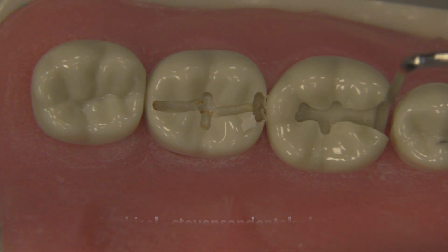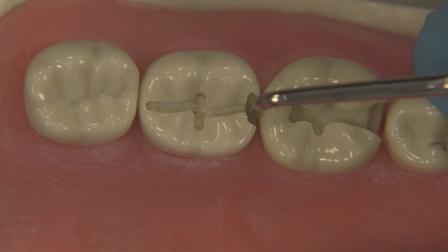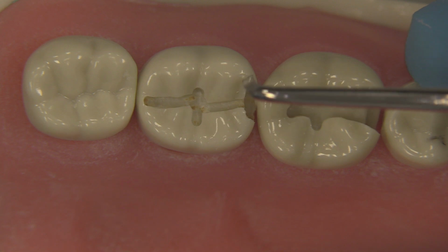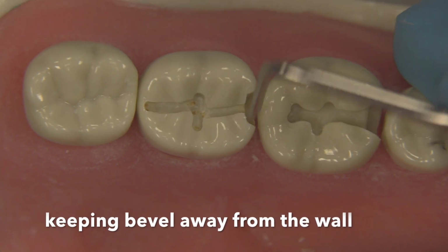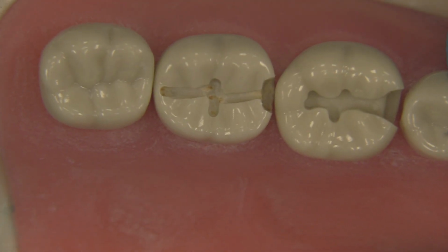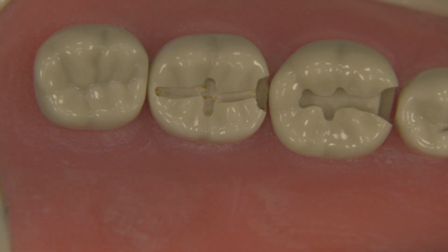And then this is what I meant by chipping. Turn the instrument around. Okay, that's how we get a box done. We'll do the same thing on the distal.